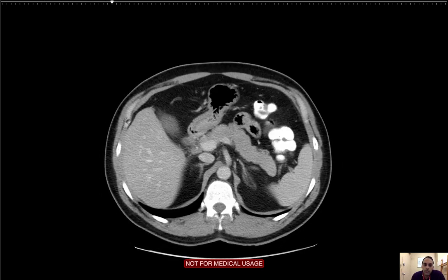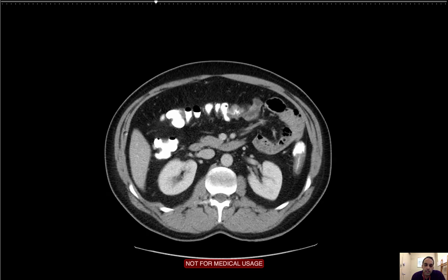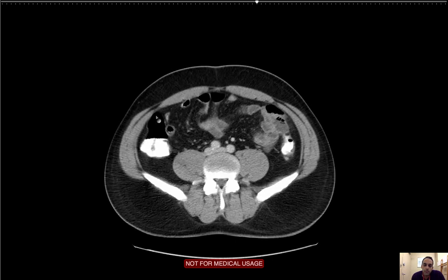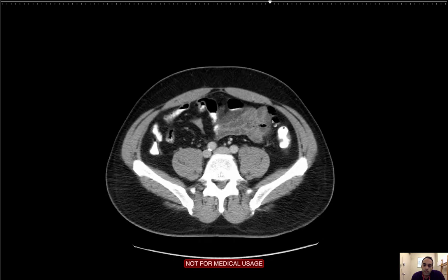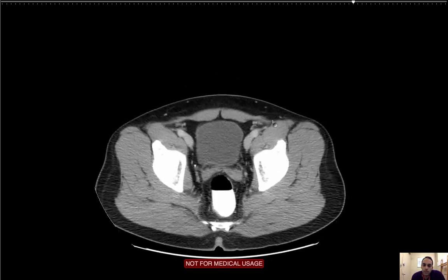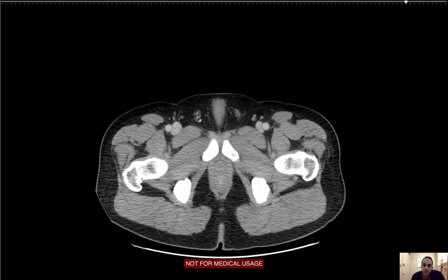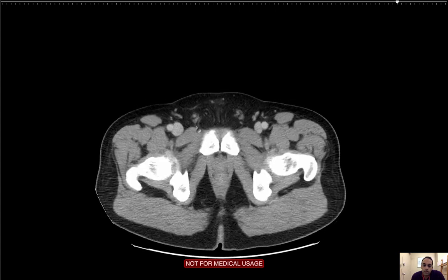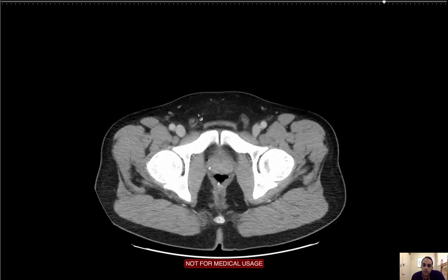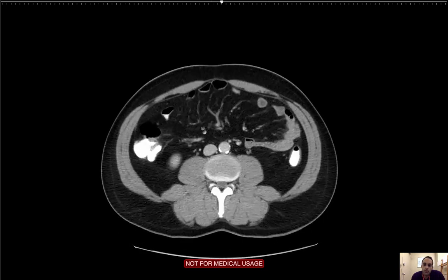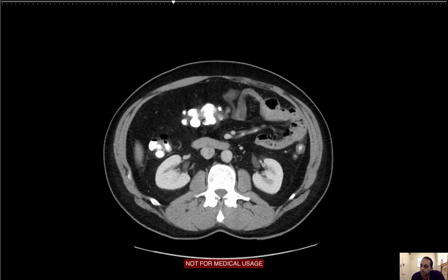I'm going to move on to the anterior abdominal wall. I'm looking at the external oblique, internal oblique, and transversalis muscle, and the recti. I'm looking for any herniation or any thinning of the wall. I'm looking for any inguinal hernias. I'm seeing the spermatic cord coming out, which is a normal finding. No herniation of bowel loops or peritoneal fat. Everything looks pretty good.